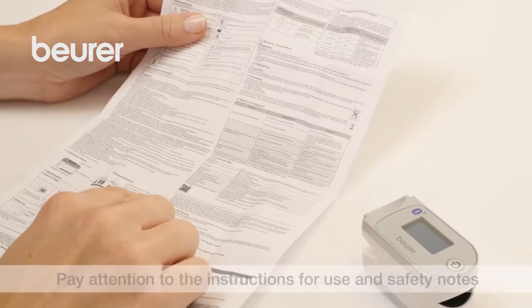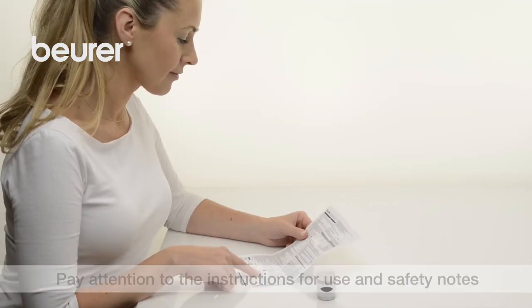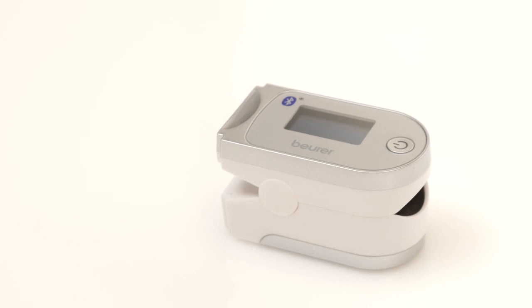Please also pay attention to the instructions for use and safety notes. We hope you enjoy using your PO60 Pulse Oximeter from Beurer. Stay healthy!